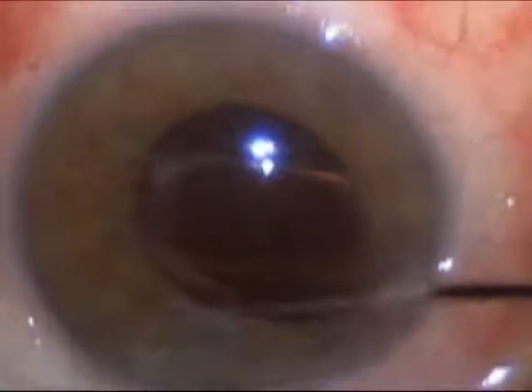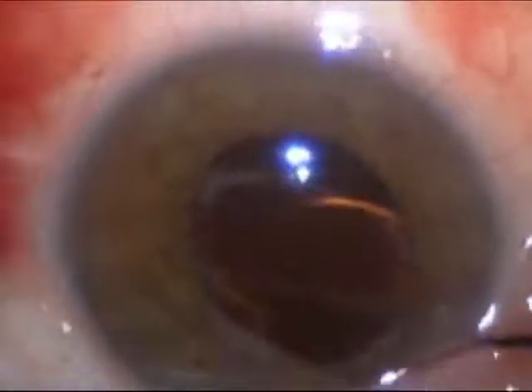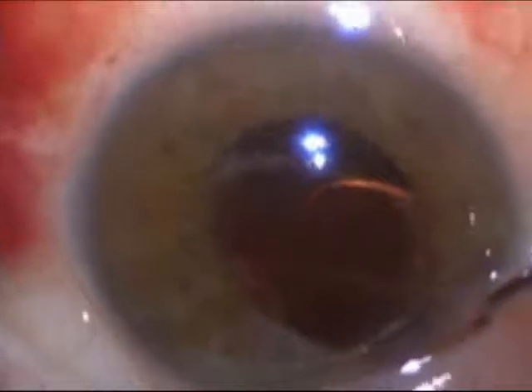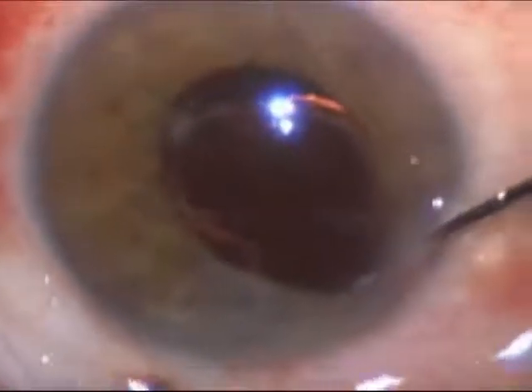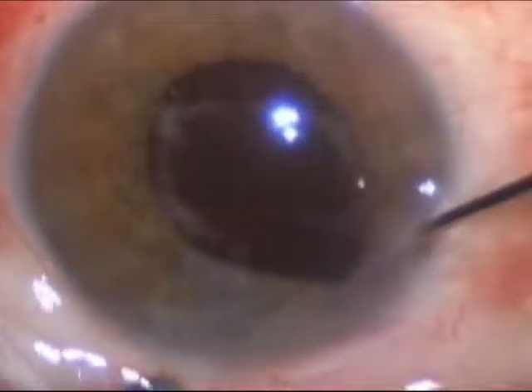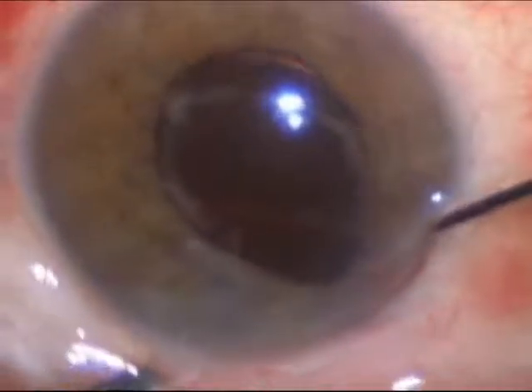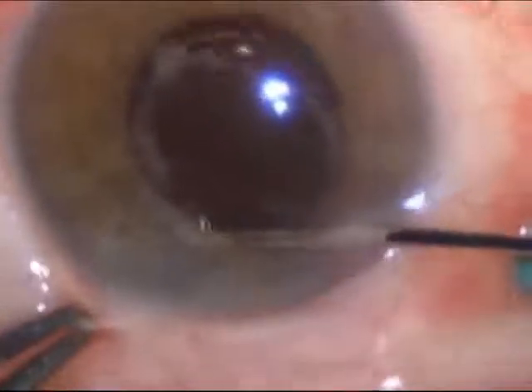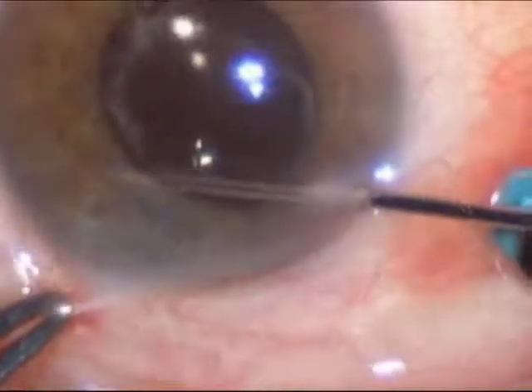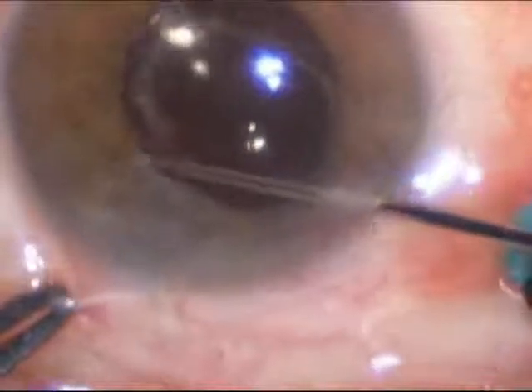Here the lens manipulator is being used to grasp the top of the lens, and the lens is being gently but firmly pushed into position and re-centered to where it should be. Even though the lens is perfectly centered at this point, it's not stable. We do the surgery with the patient lying on his back, and when the patient sits up, there's a good possibility this lens will move out of position.